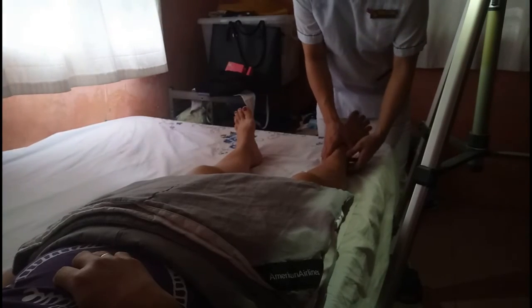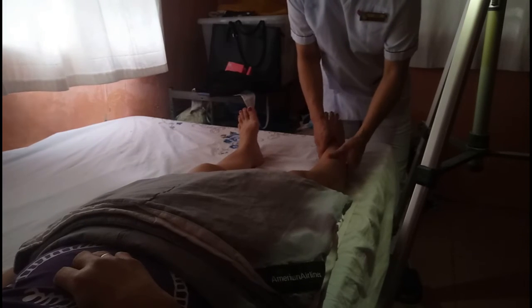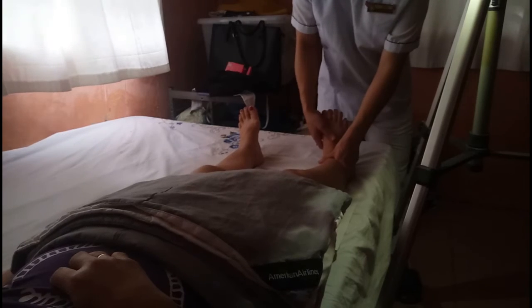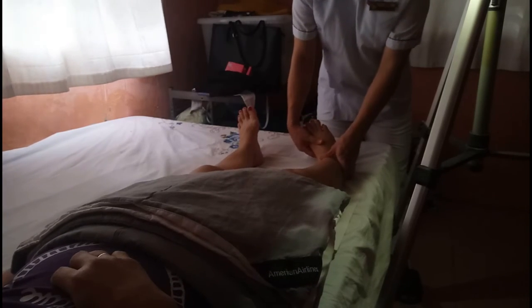As for medial rotation, the position of part is medially rotate the limb and elevate the hip of the affected side enough to rotate the limb 45 degrees. Place support under the hip if needed. Shield gonads.